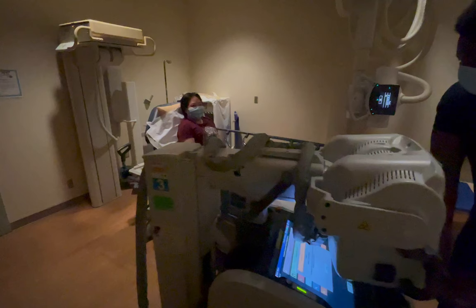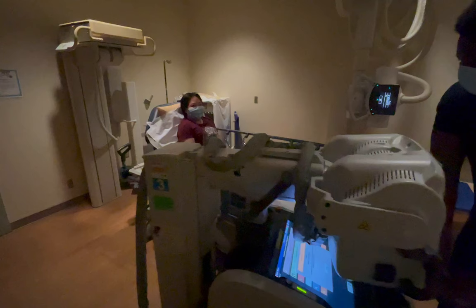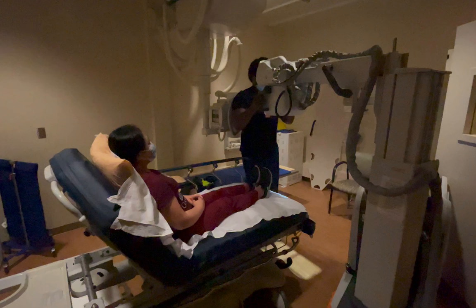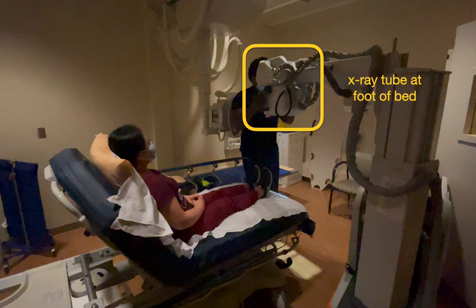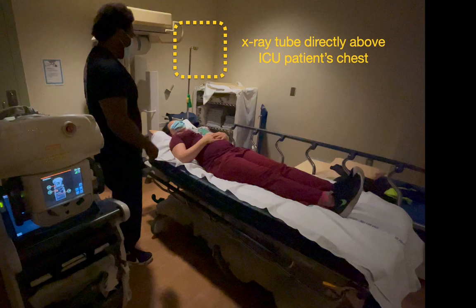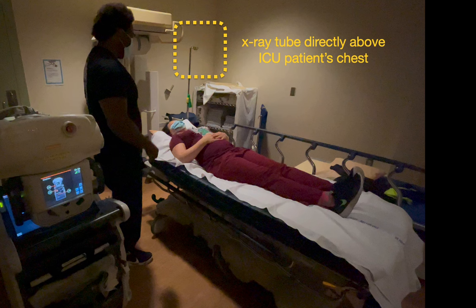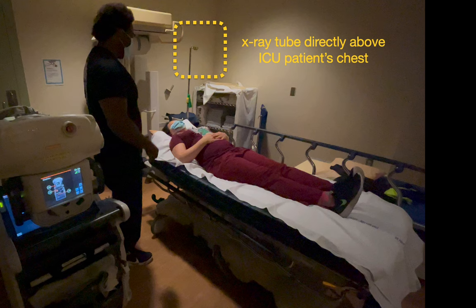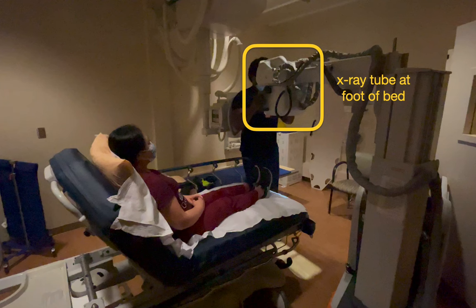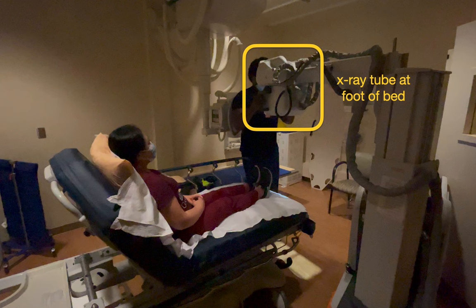Next, the x-ray tech will move and unstow the portable x-ray machine and position the x-ray tube above the patient and near the foot of the gurney or bed. In ICU patients where the patient is often sedated, intubated, and lying flat, the x-ray tube would be placed directly above the patient's chest. However, in patients who are on the wards or in the ED, usually the patient is able to sit up and so we place the x-ray tube at the foot of the bed.